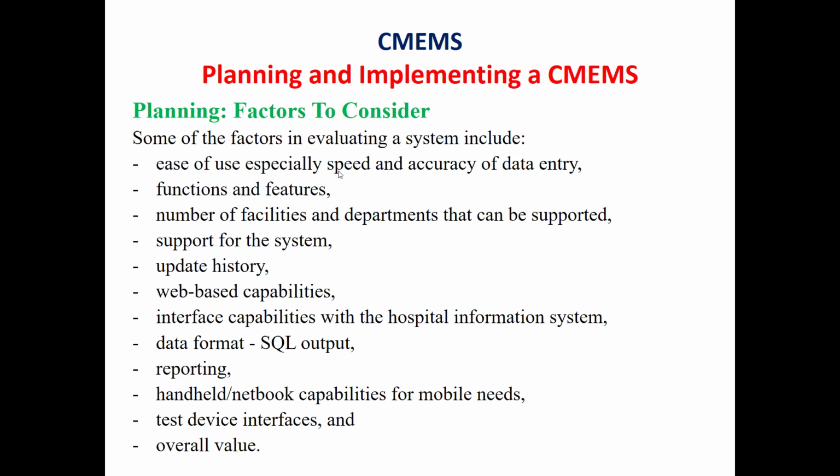Also, in the third part, I will talk about the computerized medical equipment management system and my proposal concerning the application of big data and artificial intelligence for the computerized medical equipment management system, and how this will help to enhance the healthcare technology industry.